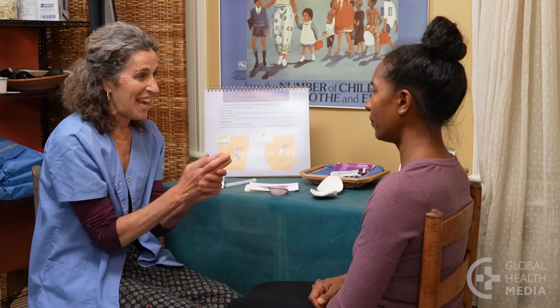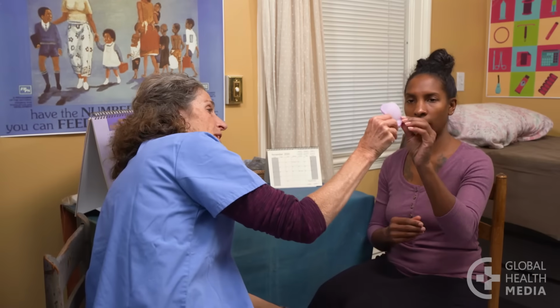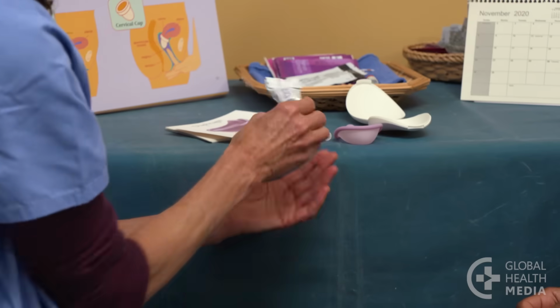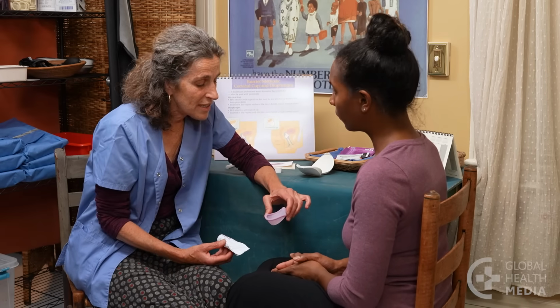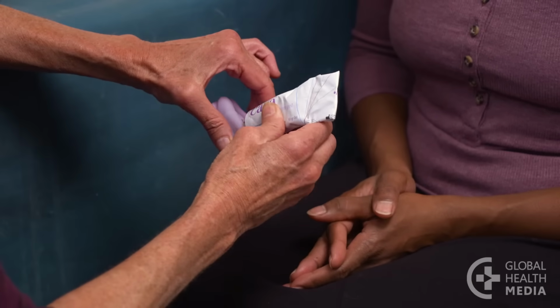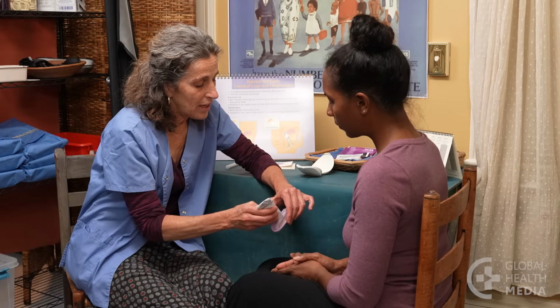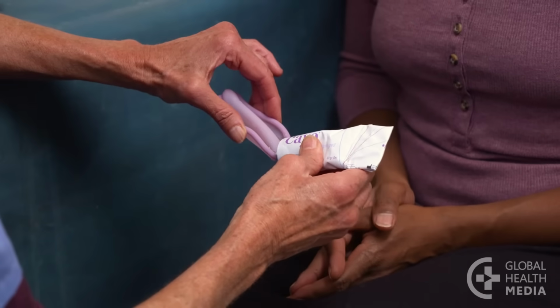Here's how. First, wash your hands. Then, check the diaphragm for holes. Next, add contraceptive gel. Hold the diaphragm at the two bumpy places. Pinch it together and place a line of contraceptive gel in each of the two folds. And a little on the rim to help it slide in easily.